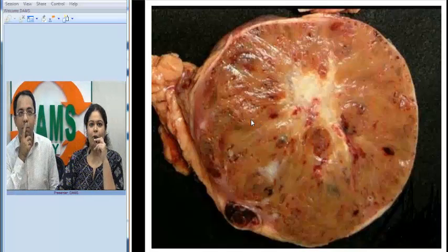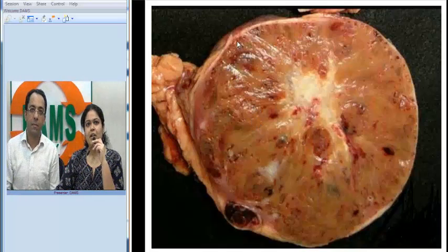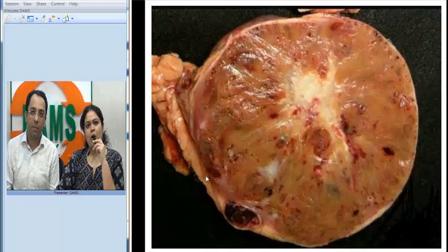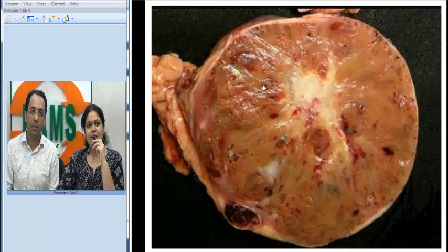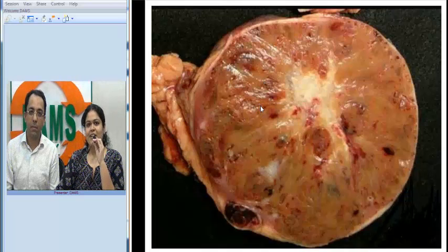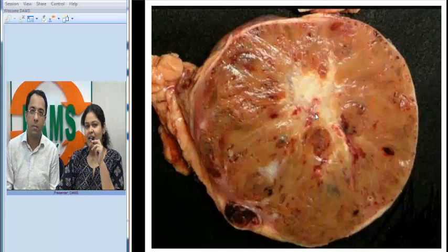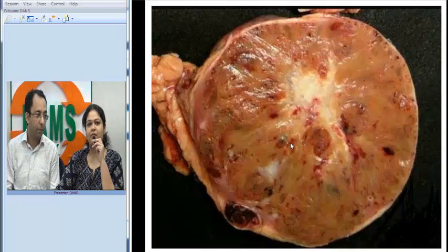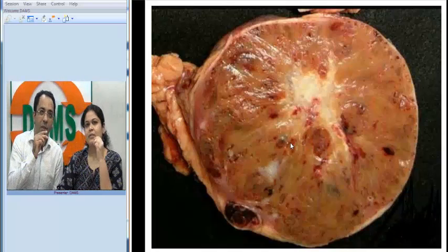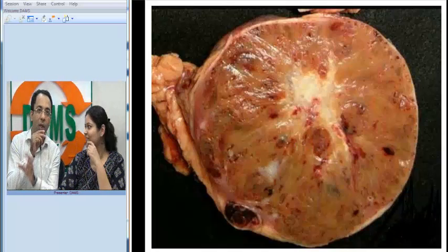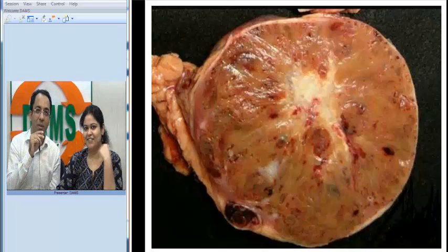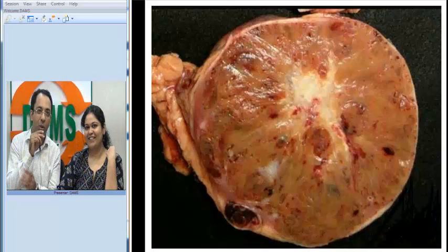The gross picture of oncocytoma is very typical. We see a well-circumscribed but non-encapsulated lesion that is mahogany brown in color — this color is best appreciated on the gross specimen. When you see this color combined with a central scar, it tells you it is oncocytoma, as Sir mentioned, in about 30% of cases. The scar correlates beautifully with what was seen on the radiological image.